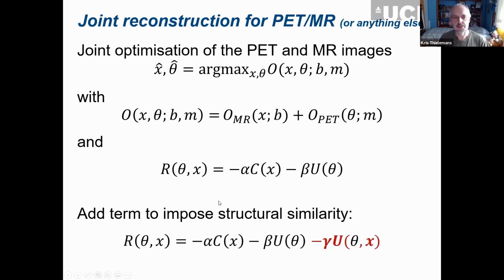The trick is, can we add another term that couples the two or three or whatever number you have together? What Andrew showed you was one way to do this. However, it was evolving over iterations. Some people, in some sense, don't like that, and they came up with prior formulations that don't need it. Which of these two is the better one? It's entirely problem dependent and application dependent.